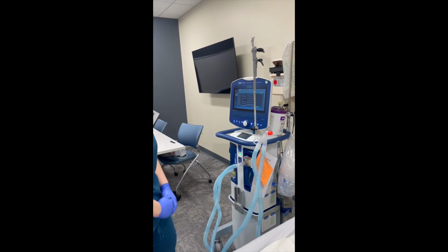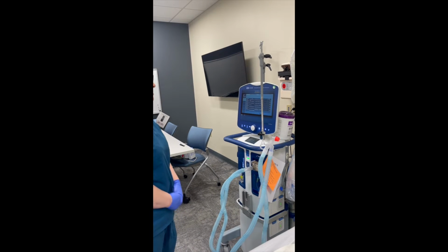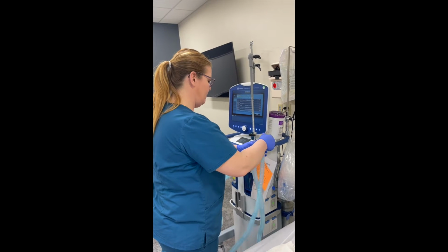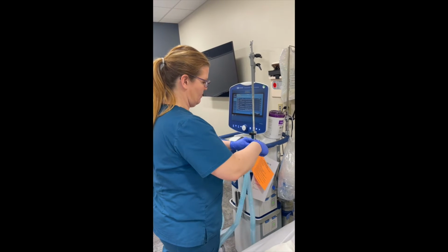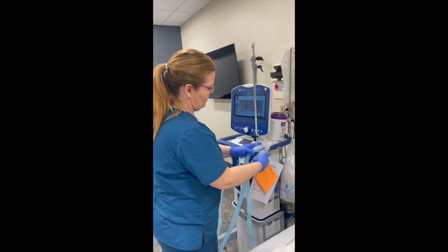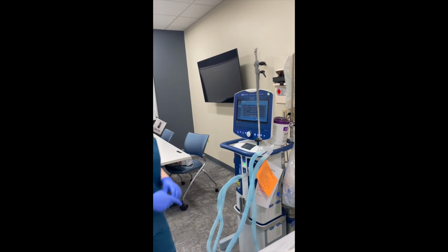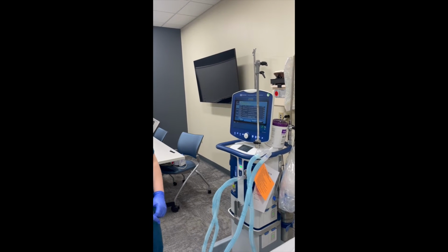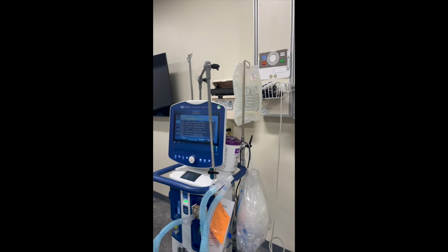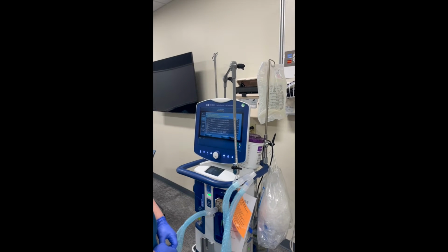Accept that. Okay, unblock the Y. Okay. And everything looks like it has passed.